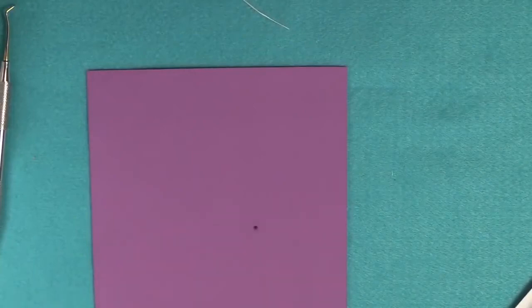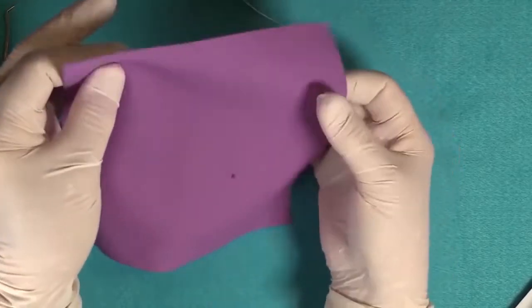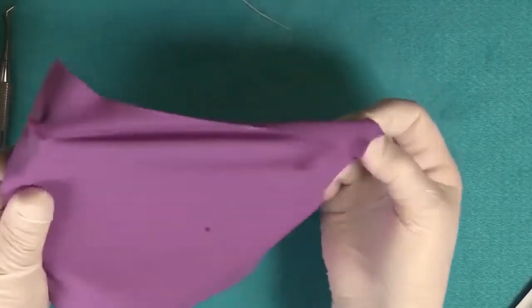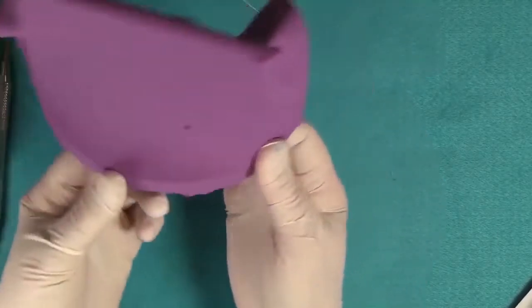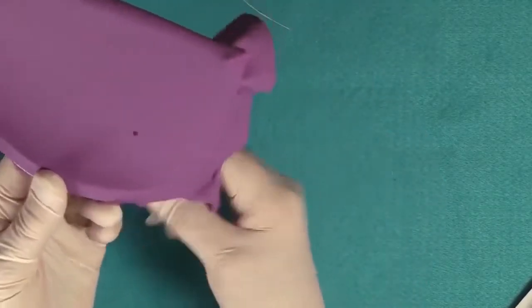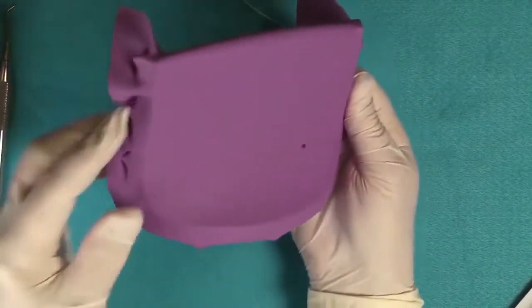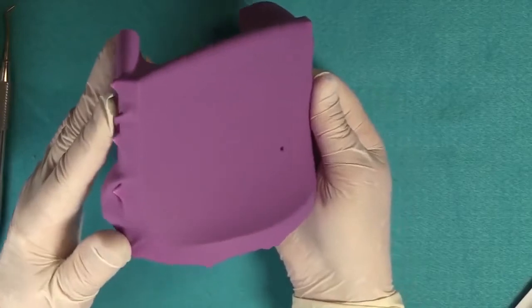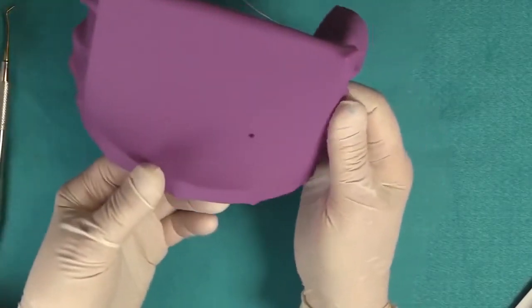Just like that. Now, to make it easy, in the wing technique, the dam, the clamp, and the frame are carried to the mouth as one unit. So, you can mark your dental dam, and now this frame is a little bit different from what some of you might be familiar with. This is the radiolucent frame, hygienic frame, and the engagement is such that the dam is placed on top of the frame and not behind it like most other frames.